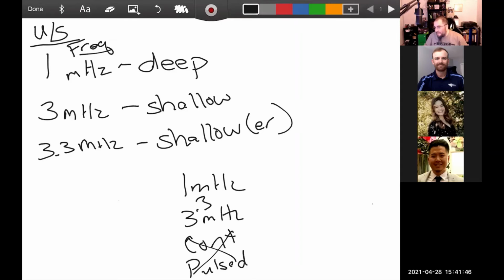A sensory overload, basically. So Mr. McKeever's trick is I always took my pen, I palpated where my spinous processes were on my patient, and I laid my pen on the spinous processes, whatever it is, plural process. And that gave me a guide where not to go. And I stayed away from my pen. All along those paraspinals, you absolutely can do it on. You just can't do it on the spine itself.